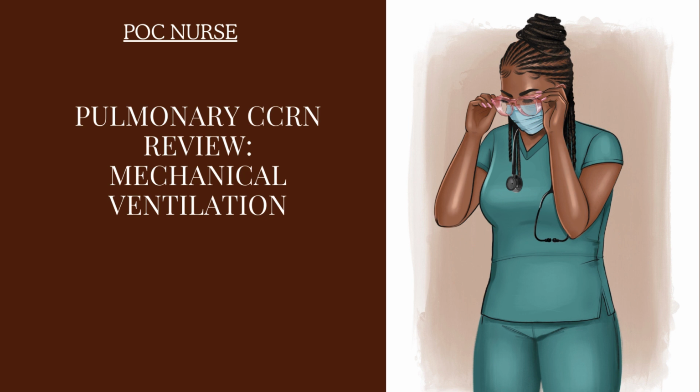Now, these are some reasons why the ventilator could start beeping high pressure. What are some reasons why the ventilator could beep low pressure? Why could the low pressure limit alarms go off on the ventilator? If the ventilator has an interruption in the circuit anywhere, that low pressure limit alarm can go off. So let's say the tubing that goes from the ventilator to the ET tube gets disconnected, because sometimes it does happen. If it gets disconnected, the ventilator could beep a low alarm.